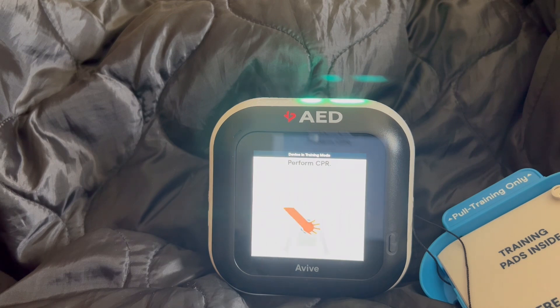It is now safe to touch the patient. Let's begin CPR. Stack both of your hands on the center of the patient's chest. If the patient is under 8 years old, use one hand for compressions. Start compressing hard and fast on each beat. Push, push, push.